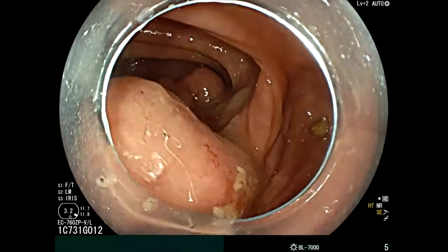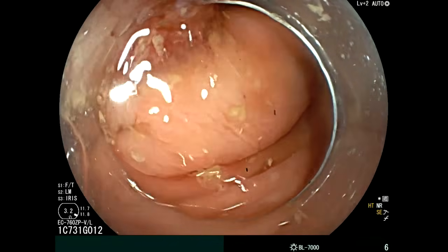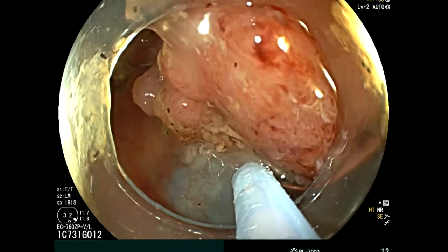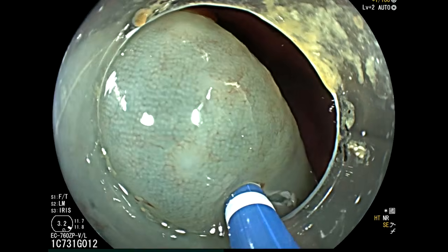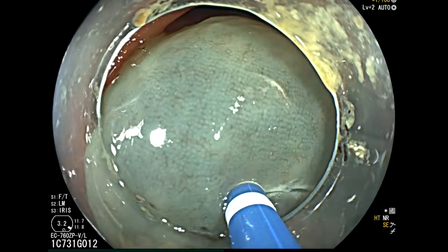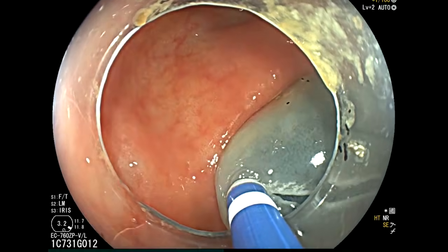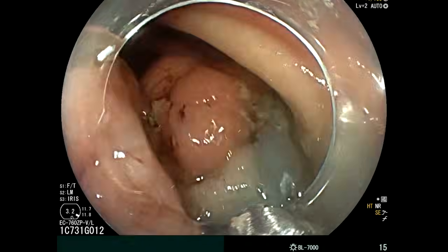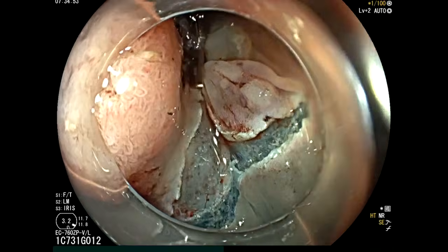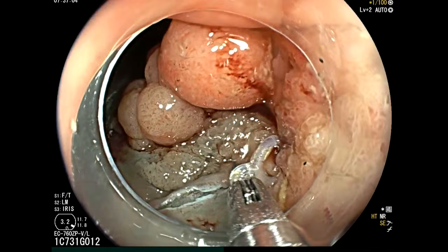Scope access was favorable, however limited access on retroflexion view. We then proceeded with circumferential injection followed by circumferential incision, which allowed us to access the submucosa for further trimming and then assess the accessibility to the submucosa. The lesion was found, however, completely perpendicular to the scope. We then proceeded by placement of a multi-point traction device using a rubber band on the anal side of the lesion to allow us to access the submucosa.